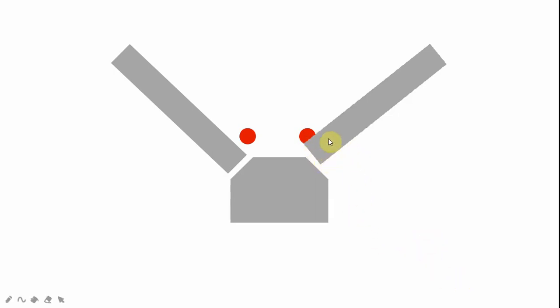So basically, this is the medial end of the clavicle that is subluxed posteriorly, and that can compress this left common carotid artery or left subclavian artery and the veins, and that can cause a lot of problems. That is why this posterior dislocation or subluxation is a time critical emergency. So I understand that he is having a lot of pain, so let's manipulate it forwards. Here we go. So it is manipulated, and the pressure on that left common carotid and subclavian artery subsided.